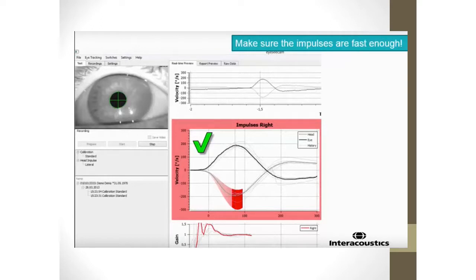In other words, you move the head fast enough. And when you don't, you get a red X that tells you, well, we're going to reject that one because you didn't move the head fast enough. So it takes a little bit of practice, but once you've got it down, you can do it on anybody who's cooperating.